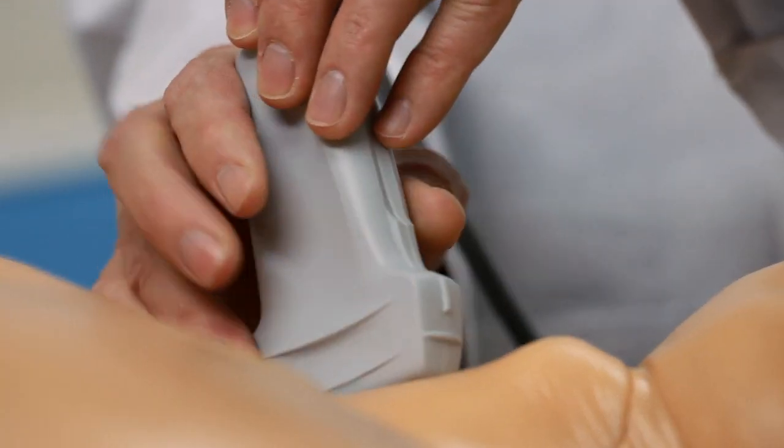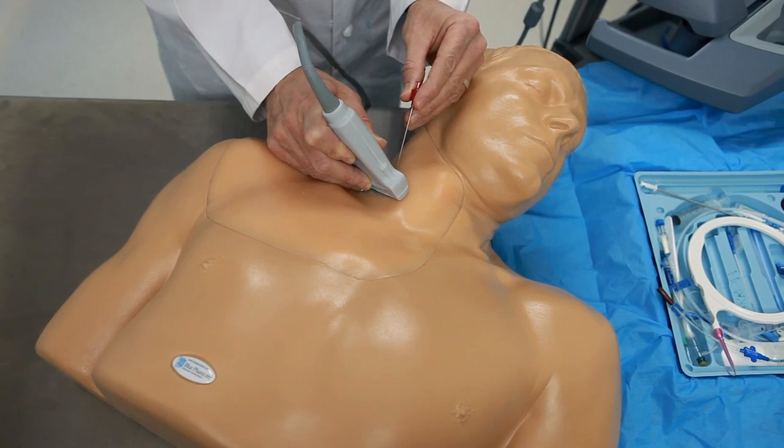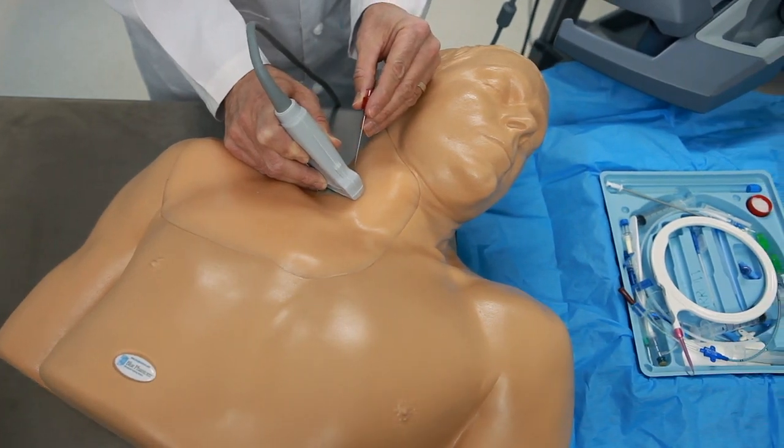This optimizes your ultrasound-guided or blind insertion technique training. When you put an ultrasound probe on the model, you'll experience excellent image quality. This model has all the vessels you need to teach, learn, and practice central venous access procedures.